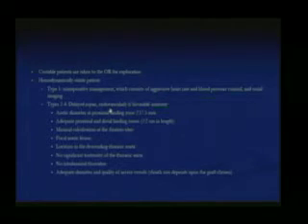For favorable anatomy, you have to see how far the lesion is from the subclavian, what the diameter of the thoracic aorta is, and what the access vessels look like, because you're putting a big 20 to 22 French sheath in the femoral arteries. If the femoral arteries are calcified, or the patient has aortoiliac occlusive disease, you won't be able to put in a stent graft, so that's going to be a problem. So you want minimal calcification, and a focal aortic lesion, because you do not want to cover the whole aorta with the stent graft, as the risk of paraplegia is going to go higher. There should not be any significant tortuosity of the thoracic aorta, and minimal or no intraluminal thrombus.